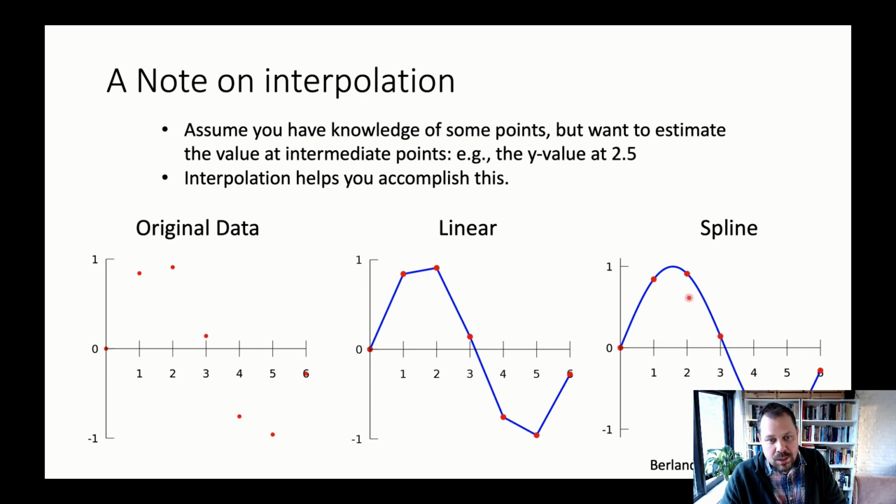In a spline interpolation, you have a different function that estimates the intermediate values between two points. That's based on this smooth curve here, and this is known to be more accurate than a linear interpolation, which is a little bit simpler and requires less computational power. And this is a way to also estimate, obviously in a more complex manner, using the surrounding voxels and what we know about the motion in different directions, the value that a voxel should have had in the absence of any movement.